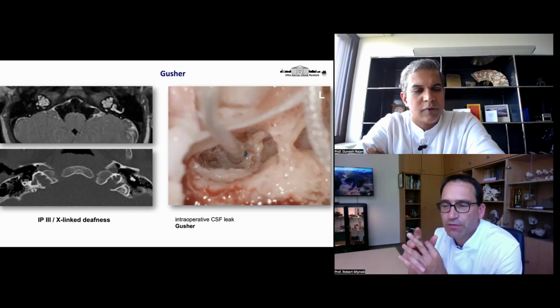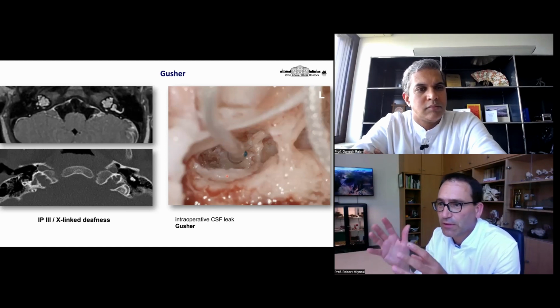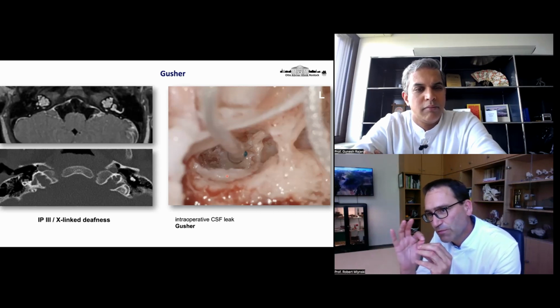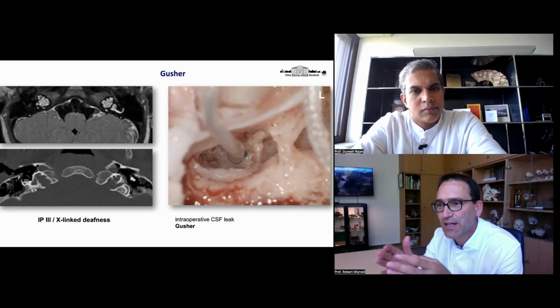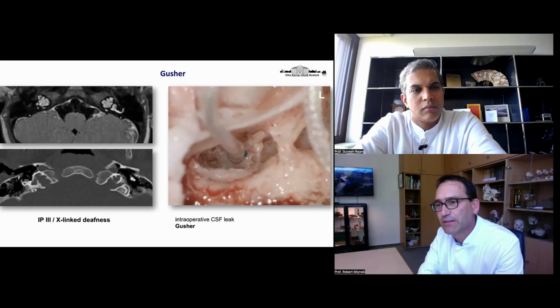Even if you have the beginning of fibrosis, if you have a meningitis case right away, even then fibrosis can start. Then the insertion test device is nice because it's a little stiff. There's one filament in it. Or now there's also a stiff probe, which is really stiff. So even if you have an Haribo jelly bean kind of fibrosis in the cochlea, you can slowly separate the fibrosis in order to get the electrode inside.